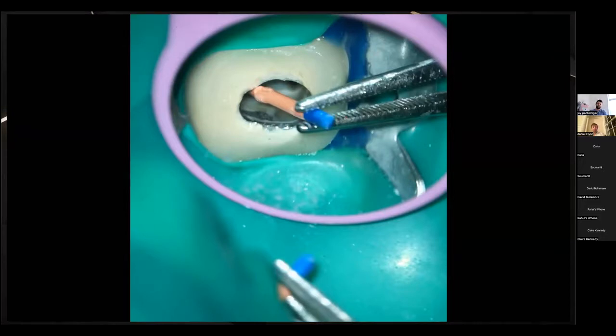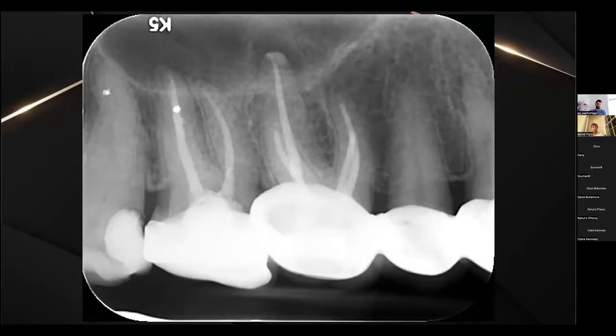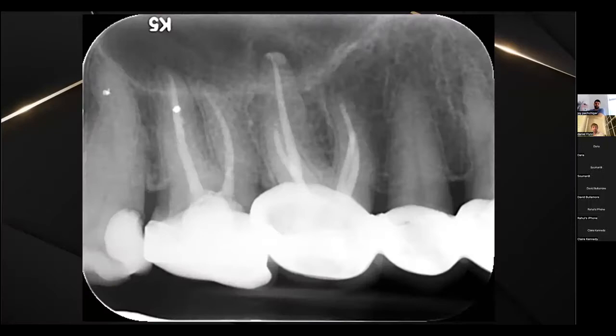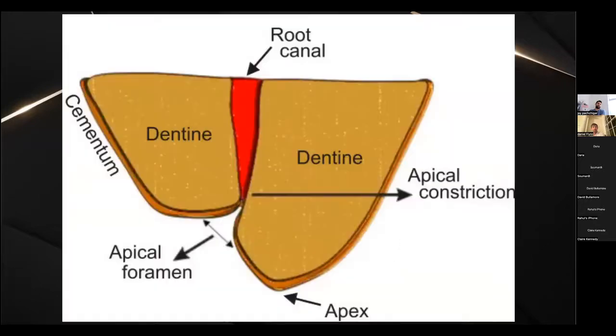So what's really helped me to get this very consistently. Also, I know some people are probably thinking, oh, he's likely just blocked or ledged that canal, and that was the stop. Obviously, it's not. We just have a good apical stop. Yes, we've got a bit of sealer extrusion, but the GP is stopping at the apex.